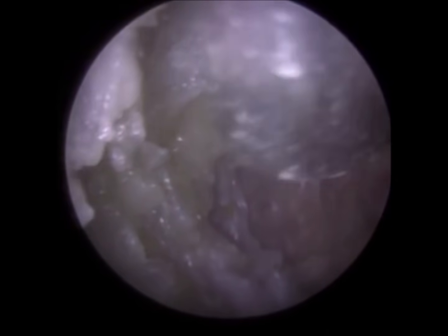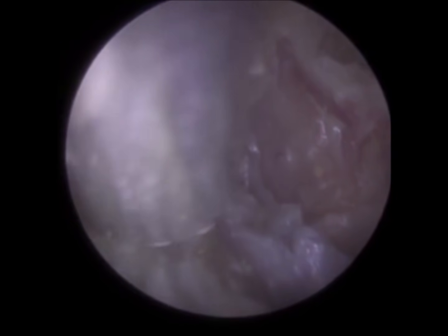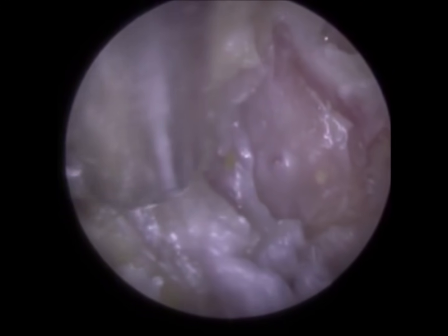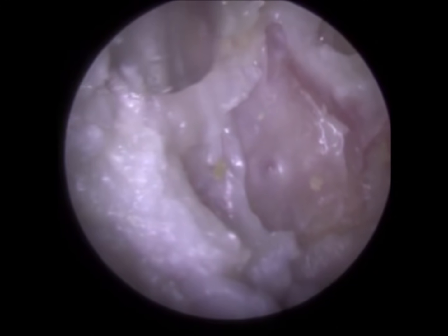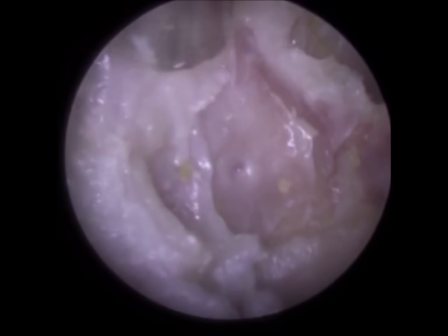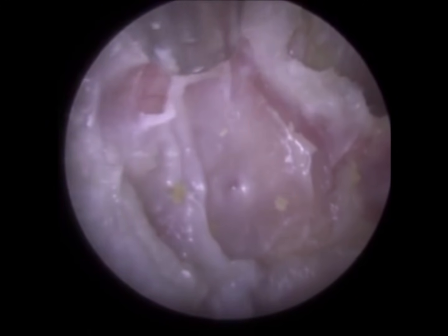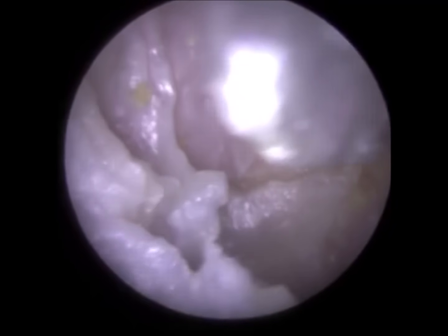So the patient was fantastic. He realised the importance that I remove as much dead keratin as possible. So we're just on the posterior canal wall near the entrance, and we're just trying to lift this dead keratin, which has become very soggy and mushy. Hence why no other instrument would do. If you use an ear hook, you're going to be scraping into the canal wall. Jobson Horn, similarly, you'll just be putting the Jobson Horn against the ear canal trying to scrape this, which would be very uncomfortable. Forceps, you just wouldn't get a grip.